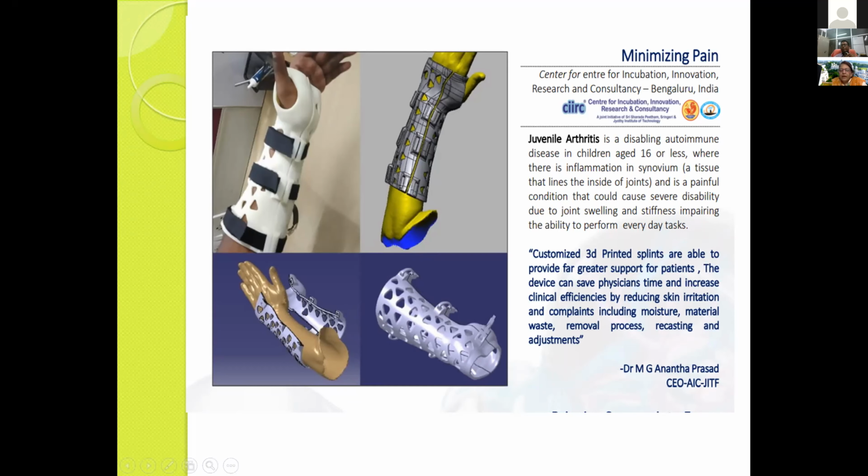Yes, I wanted all to understand that if we can scan a thing using an intraoral scanner or an extraoral scanner, fine. But suppose we already have a model of that, and we don't have the patient now, so we can't scan the patient directly. Instead, we have that model and we want to scan the model. That is the time when we actually require a lab scanner to scan that model.